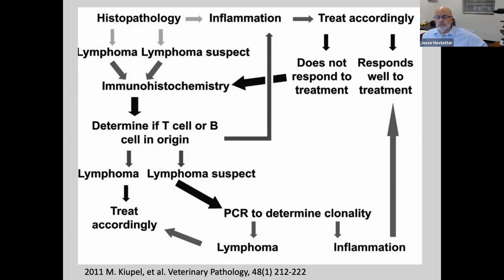The first one was the colon case scored, the loss of goblet cells is listed separately, as it is not an indicator of crypt attenuation. In that scoring system, it is listed differently. I think it's part of the same process.